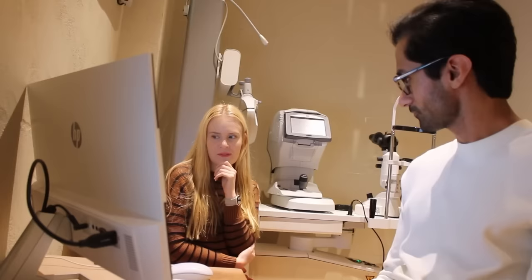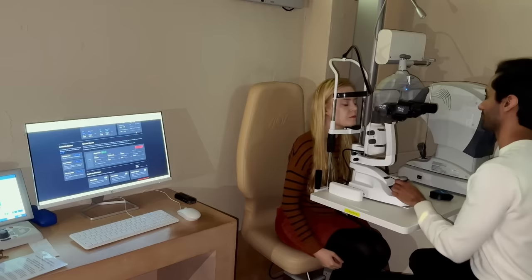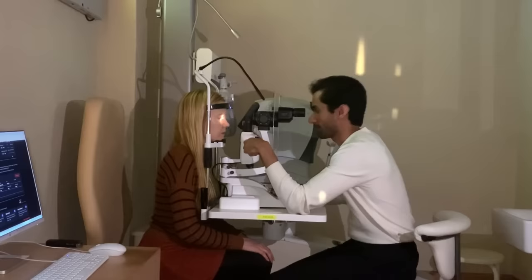There's one more thing I want to do. Let's check the back of your eye, the health. Oh, okay, yeah, sure. Can you just pop your chin onto there for me, please? Is that a comfortable height? Yeah. Okay, so you should look at my ear here for me.